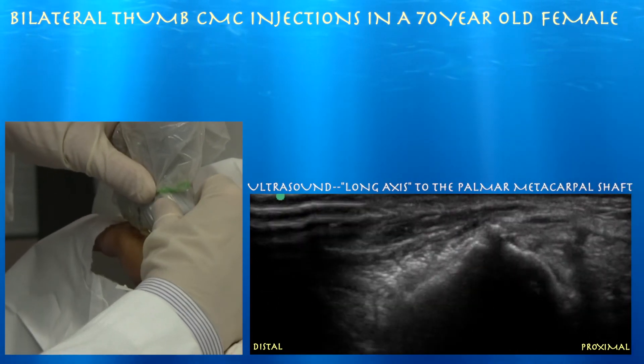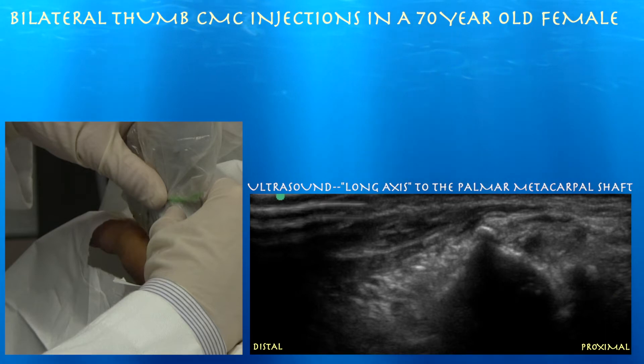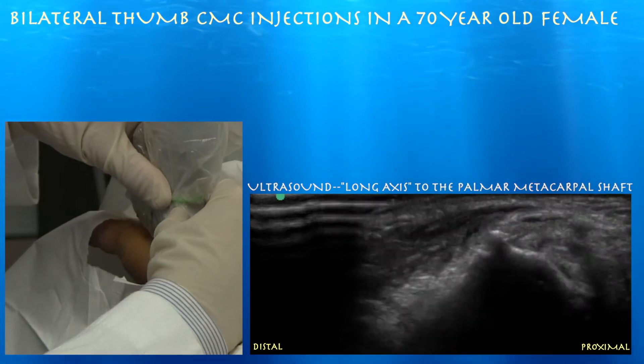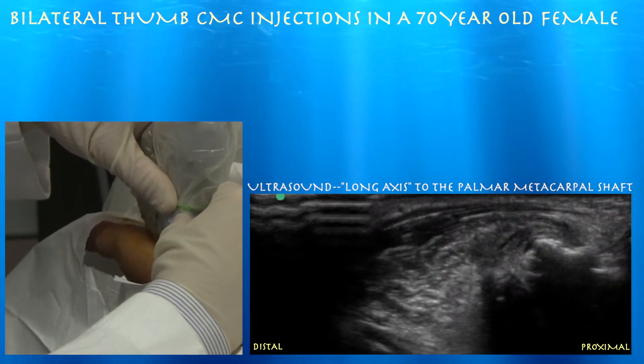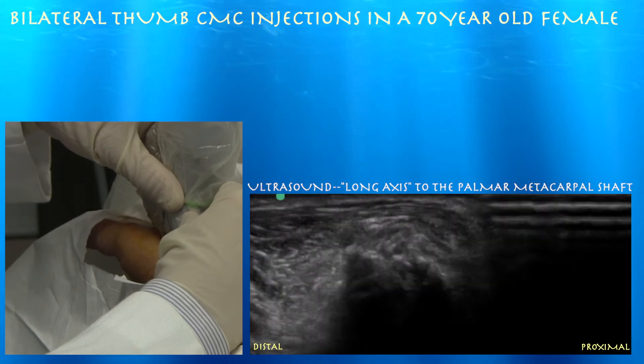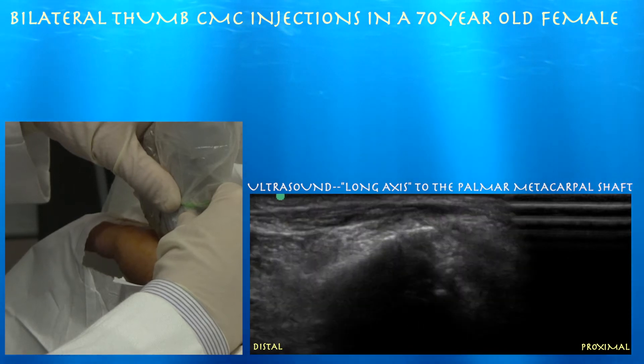Here's our first metacarpal. Here you can see the metacarpal base abutting the trapezium on the right side of the screen — quite an arthritic joint. Going proximal, that's our CMC joint. Pretty arthritic. Here's another view of the joint and you can see pretty clearly how the surfaces are essentially abutting each other.